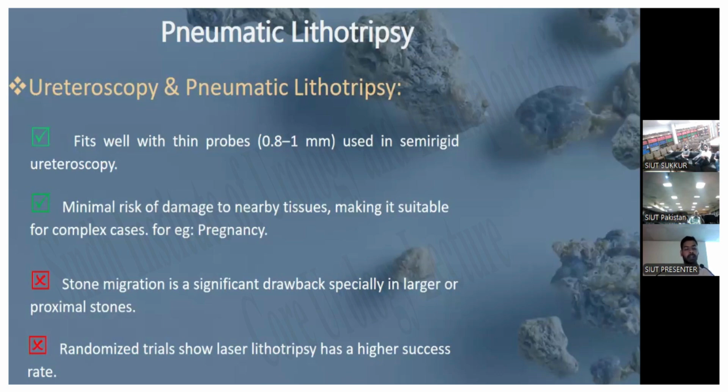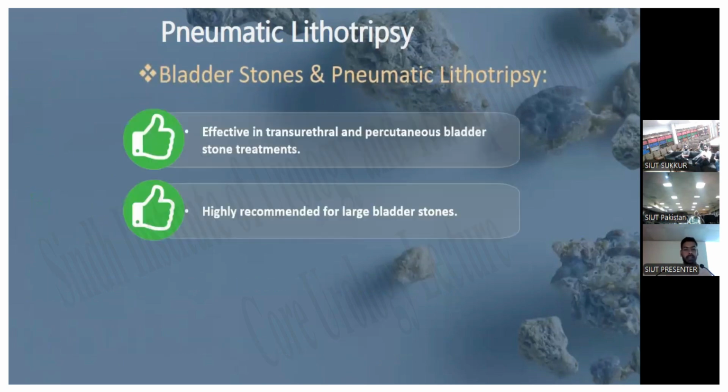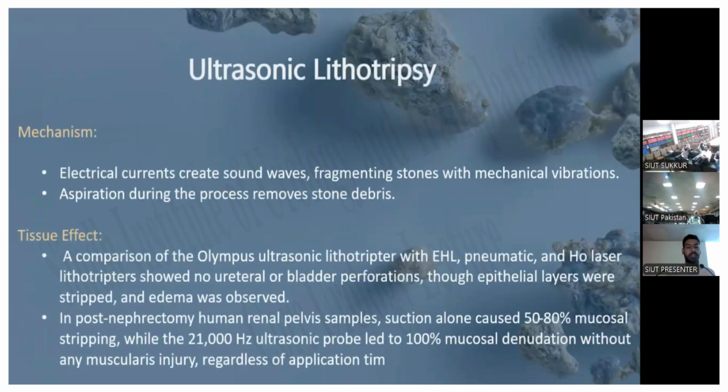And randomized trials show that laser lithotripsy is superior to pneumatic lithotripsy. And for bladder stones, pneumatic lithotripsy is very effective in transurethral and percutaneous bladder stone treatments as well, and is highly recommended for large bladder stones.